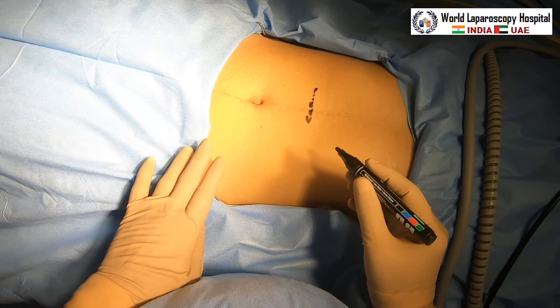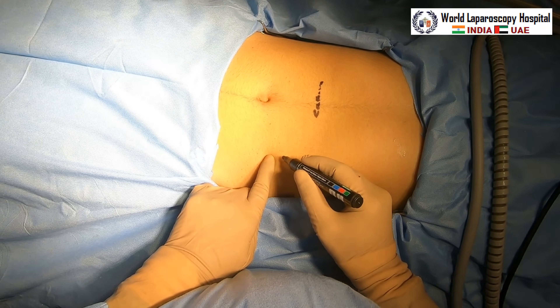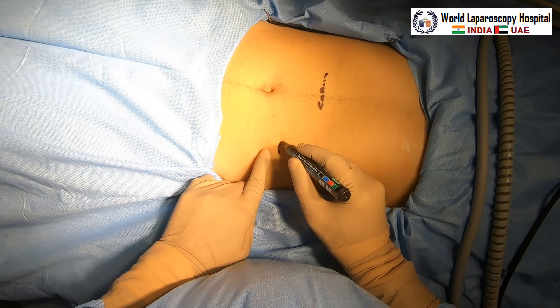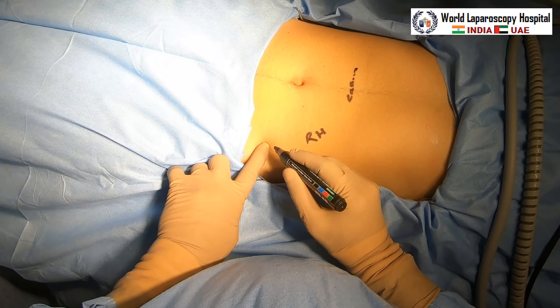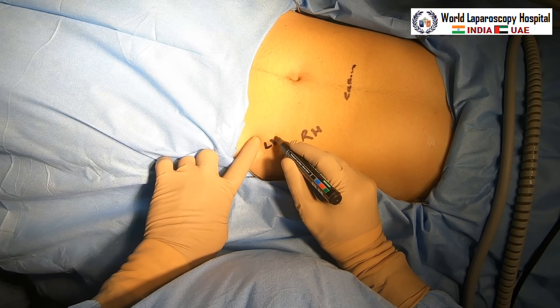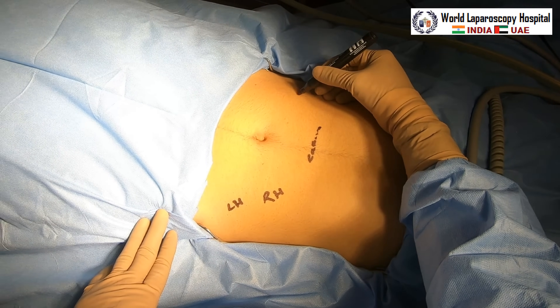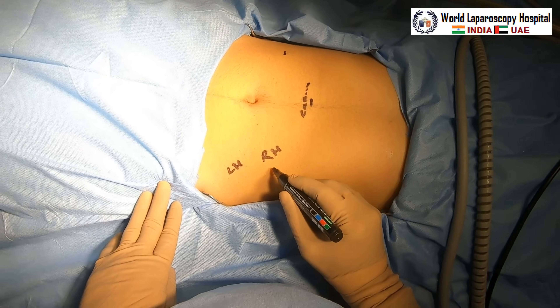This is the camera port we are planning to put suprapubic, because there may be blood inside and in that situation, once you introduce it, it may be necessary to do the procedure with a little distance from the telescope. This is the right-hand port and this is the left-hand port. These ports are planned ipsilateral, and if required, one contralateral port can be added — this is the baseball diamond concept.